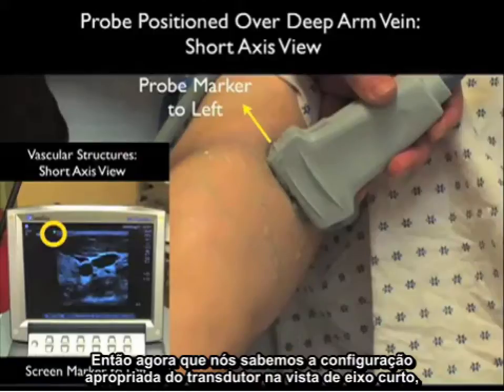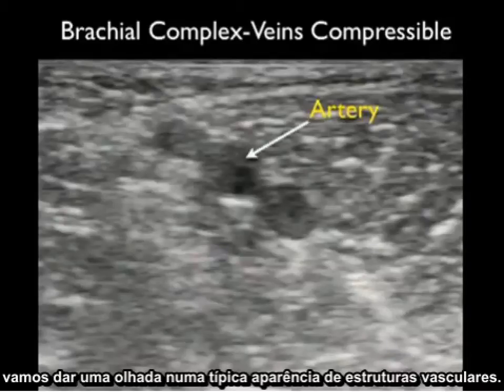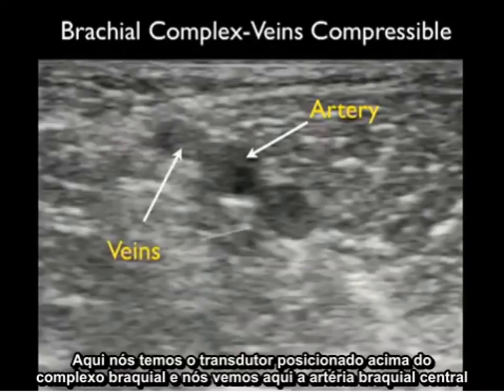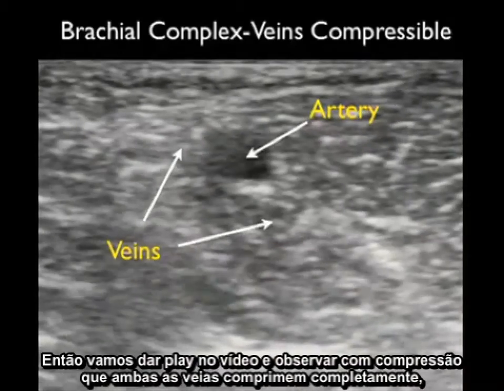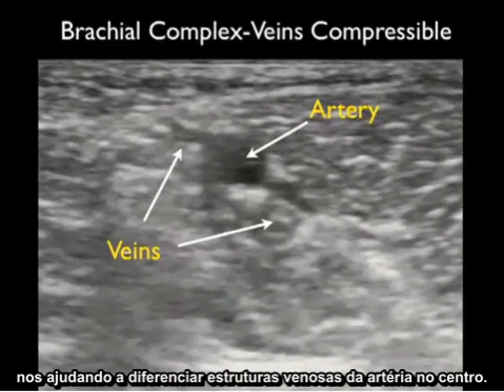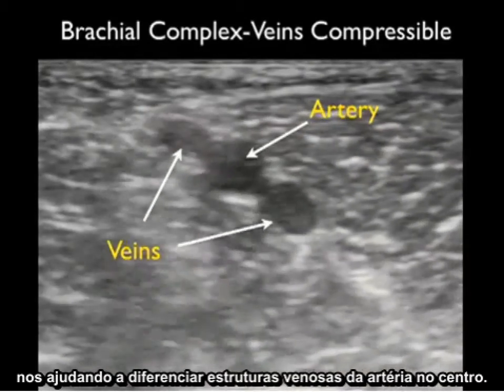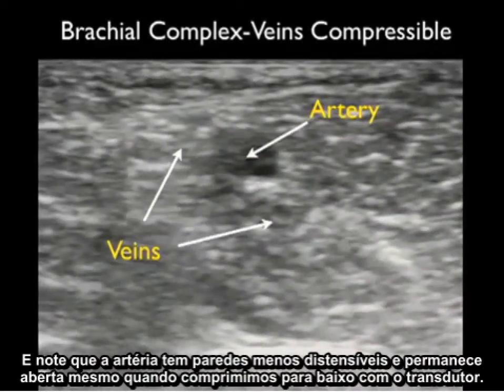Now that we know the proper configuration of the probe in short axis view, let's look at a typical appearance of vascular structures cut end-on. Here we have the probe positioned over the brachial complex and see the central brachial artery surrounded by two deep brachial veins. With compression, both veins compress completely, helping us differentiate them from the artery, which has less distensible walls and stays open even as we compress down with the probe.